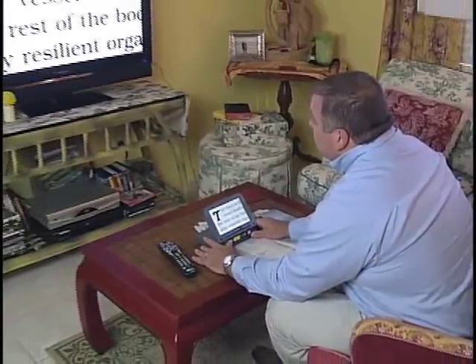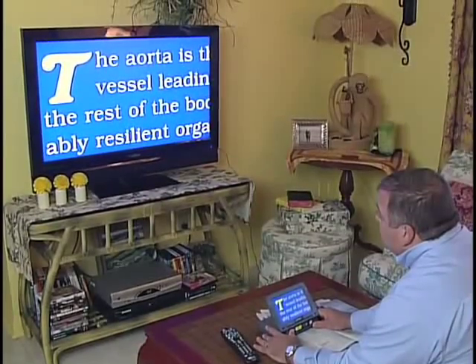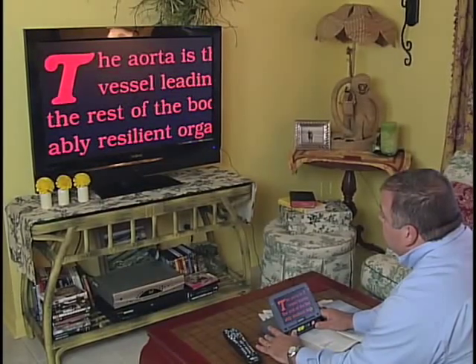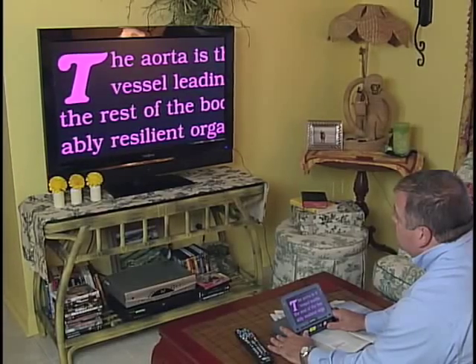Magnify even larger by plugging the Sapphire into the TV in your home or hotel room. Choose from up to 23 configurable high contrast viewing modes for crisp, clear, easy reading.